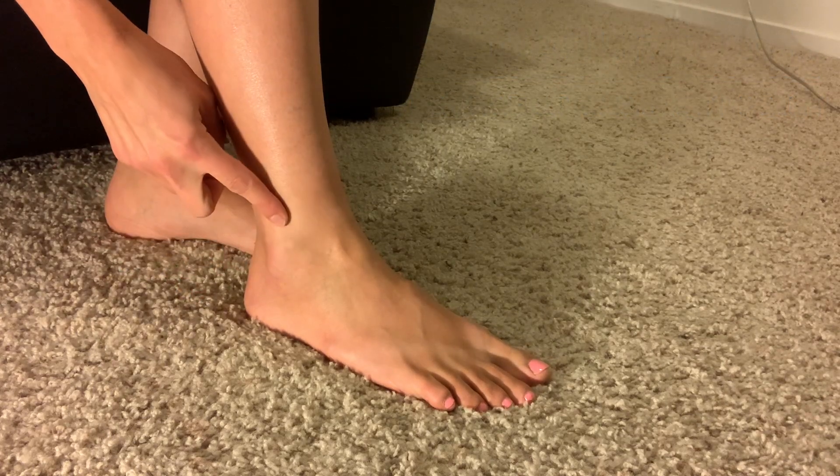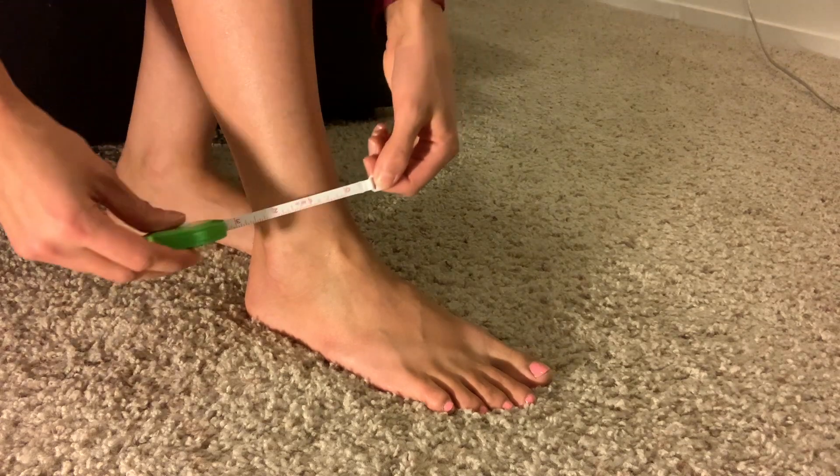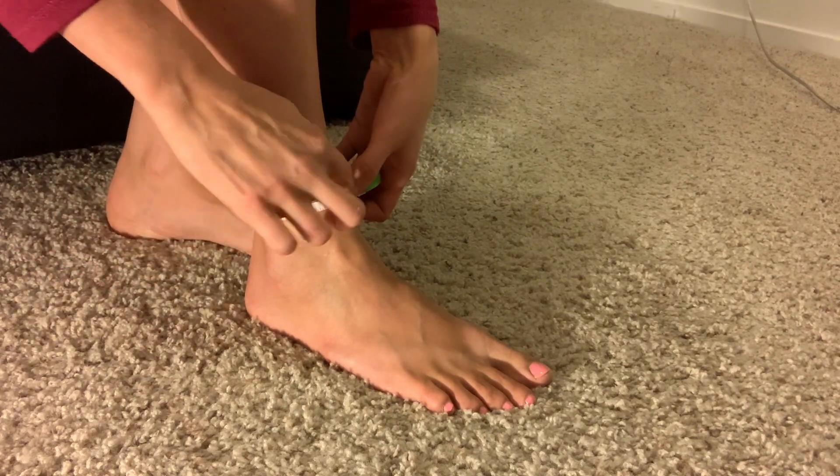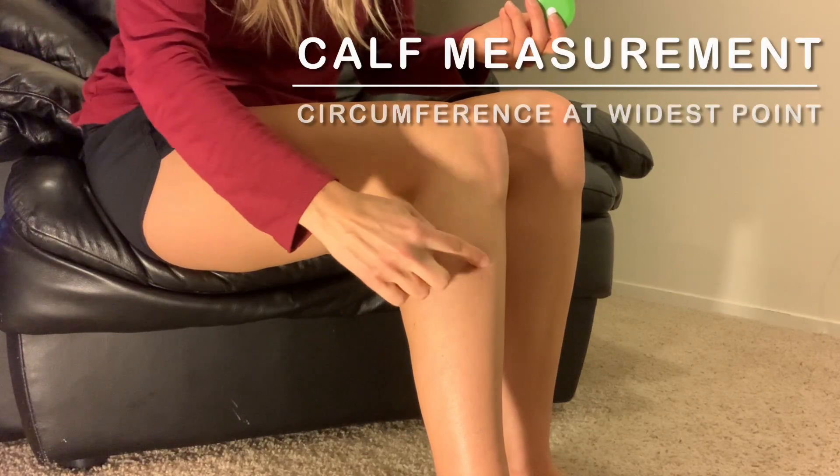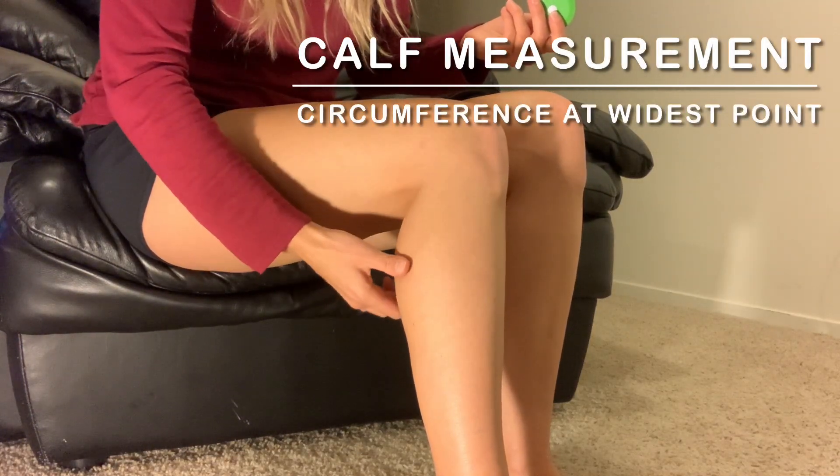For the ankle measurement, you want to measure around the smallest part of the ankle, which is right above the ankle bone. Next, for the calf measurement, you're going to measure around the widest part of the calf.